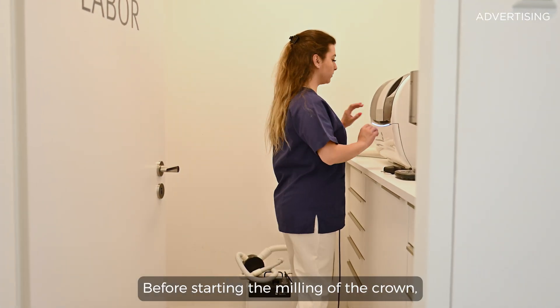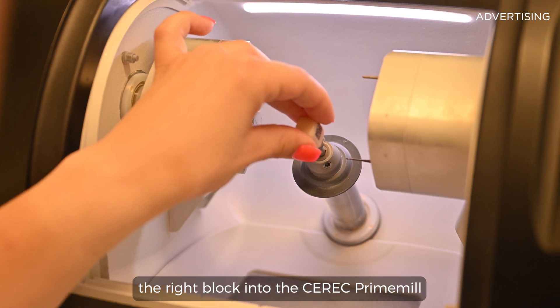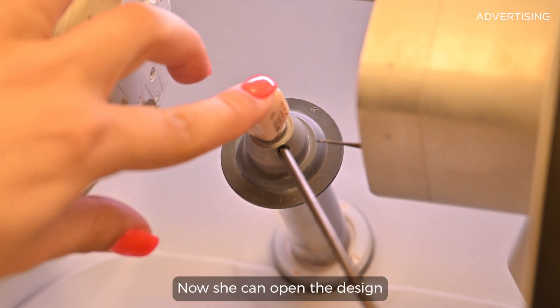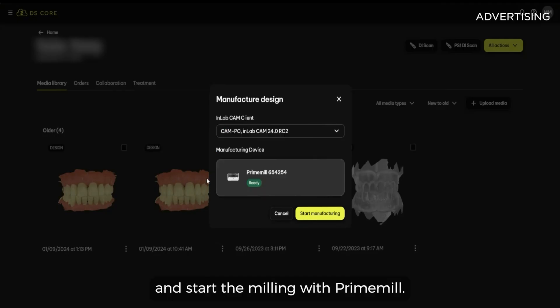Before starting the milling of the crown, my assistant inserts the right block into the CEREC prime mill using the block scanner. Then she can open the design file in DS-Core on the tablet and start the milling with prime mill.